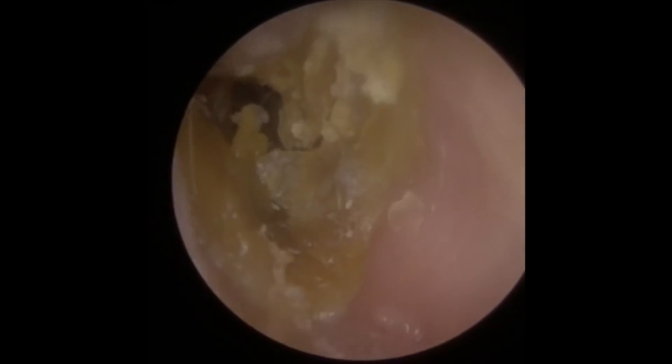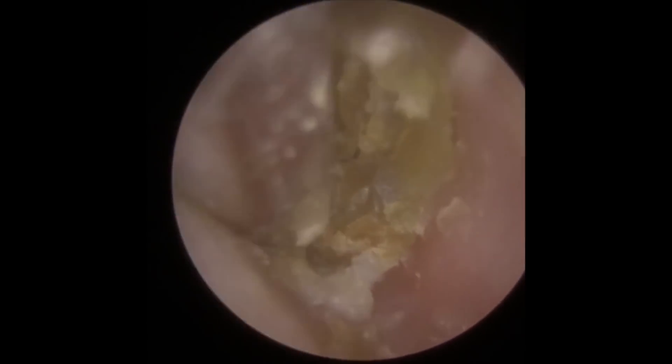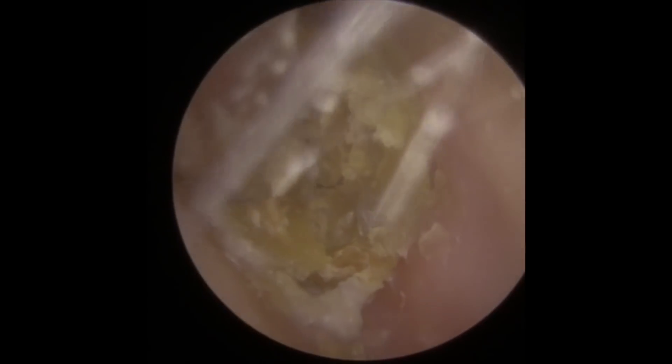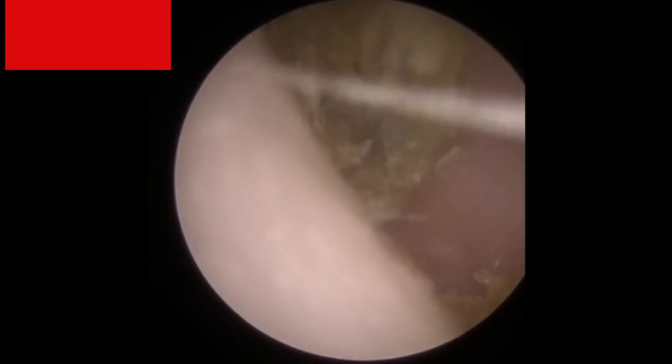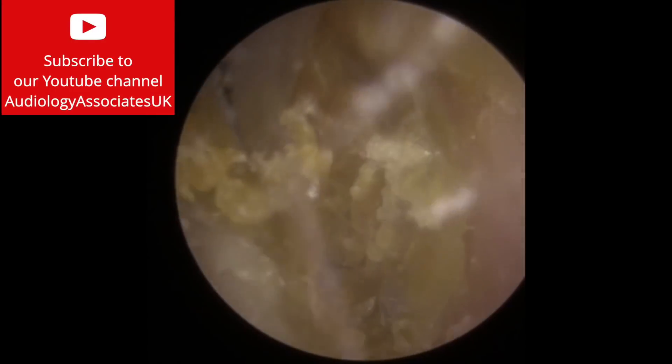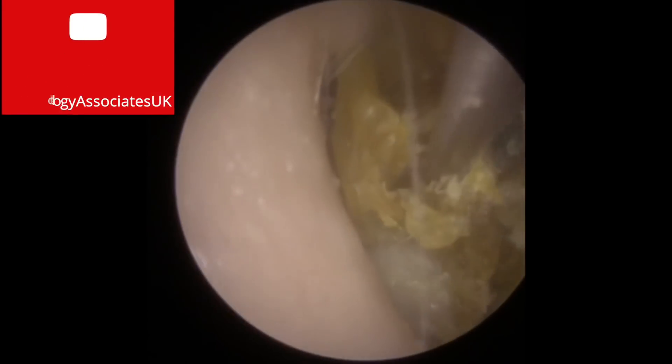What we're doing here first of all is just clearing the outer part of the ear canal, getting rid of some of the looser debris at the entrance. What you can see then is we've got a harder plug, almost perfectly formed to the shape of the ear canal. We're going to lift from the sides because at the moment it's quite firmly attached on each canal wall.